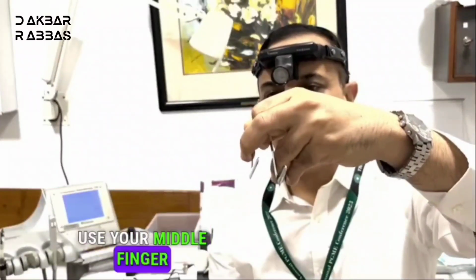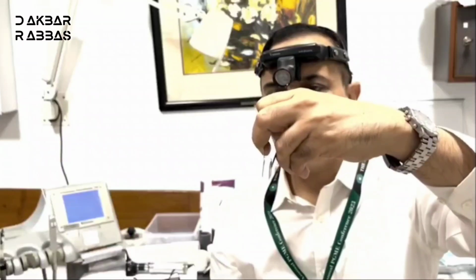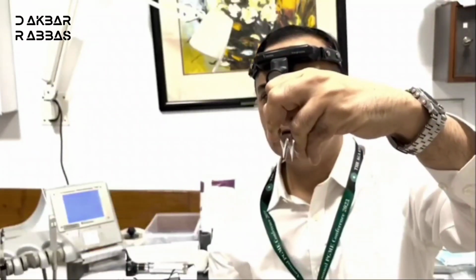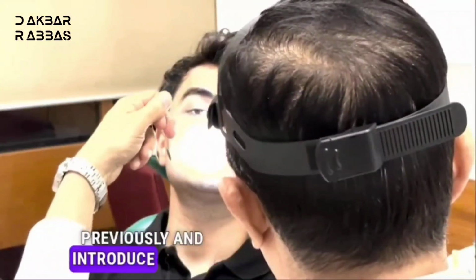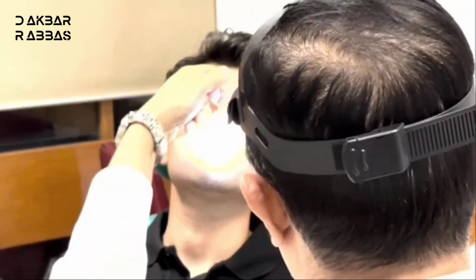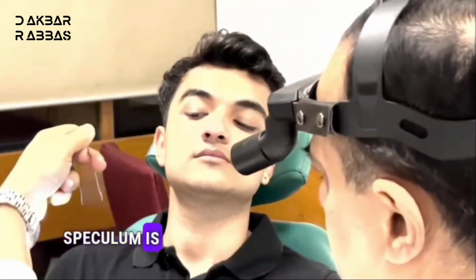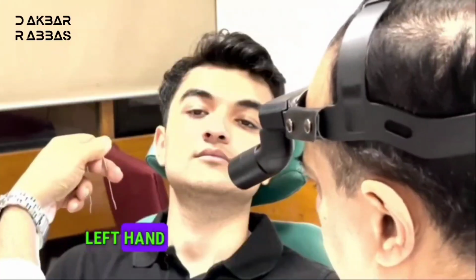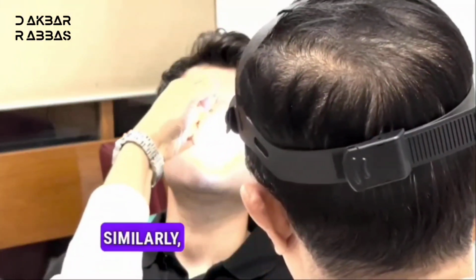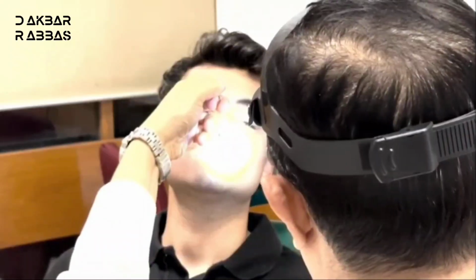use your middle finger and fourth finger, the ring finger, to close it and open it smoothly. We'll hold it as it was explained previously and introduce it gently into the nasal cavity like this. So the speculum is always held in the left hand and never in the right hand. Similarly, the left side of the nose.